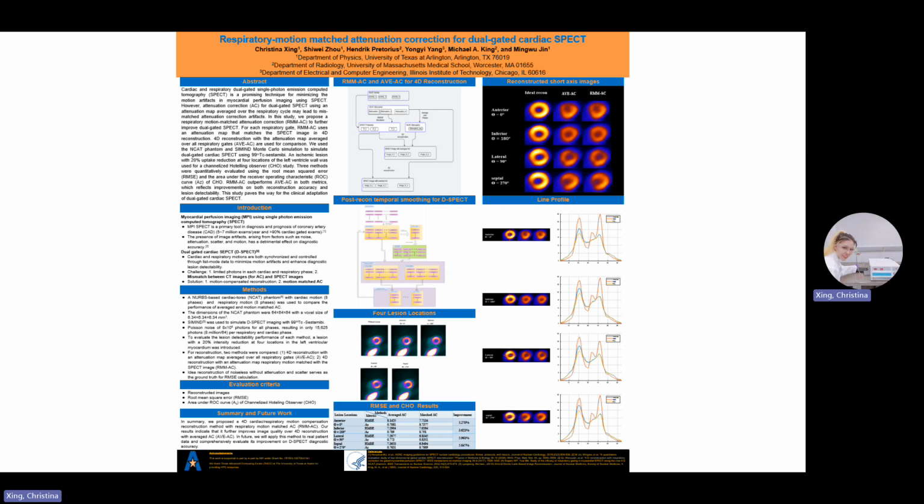Let me first introduce a little background about the SPECT system. SPECT stands for Single Photon Emission Computed Tomography. It is a diagnostic imaging technology enabling three-dimensional imaging of the distribution of a radiopharmaceutical within the body. Like other nuclear medicine imaging techniques, it provides information about the function of tissues and organs, while modalities like X-ray, CT, and MRI primarily offer anatomical details.